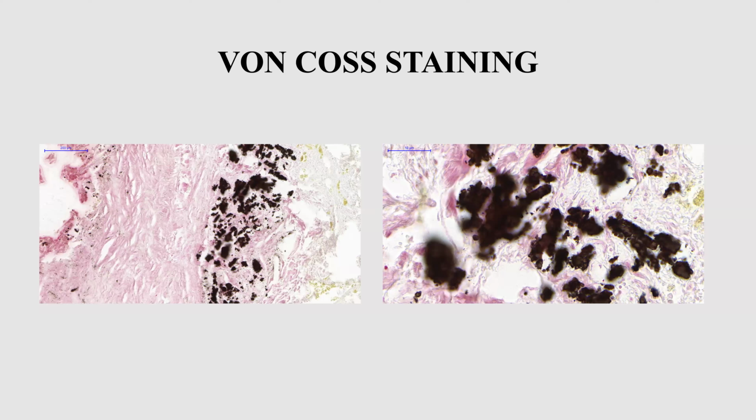I brought this fast red from Sweden. I asked some old professor. These chemicals were from the 70s, very old, but as we can see, it's still working. It's amazing.